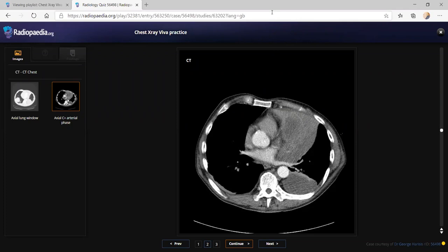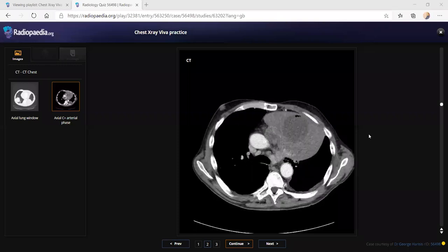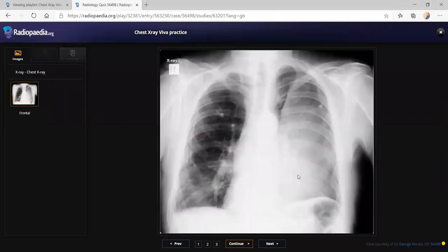Okay. How did you do? It's not at all great. Okay. So this will actually be a starter film in your examination, but you got it at the last. So don't use the term ground glass opacity in a radiograph because usually you reserve it for CT. It's a veil-like opacity in the left hemithorax, and you can see the Luftsichel sign, you correctly told.